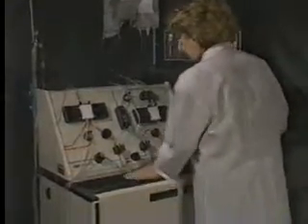Close the centrifuge door and cover. You have now finished installing the centrifuge channel. Now let's take a look at this process from beginning to end before going on to the workbook exercise.